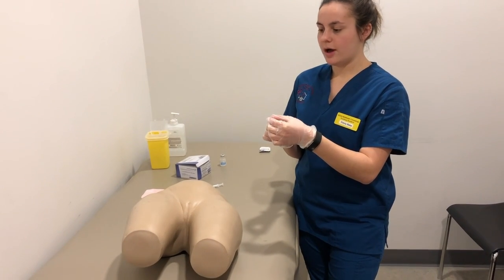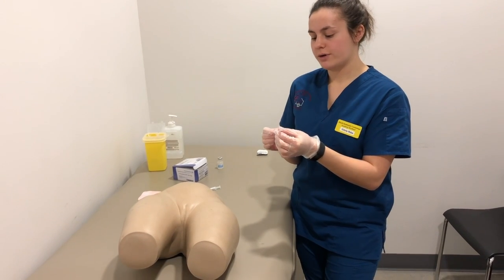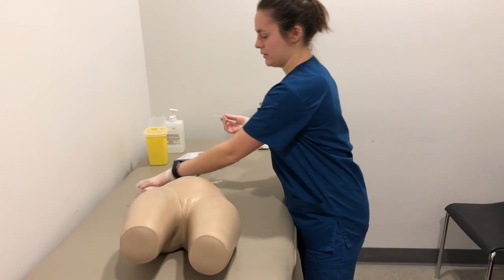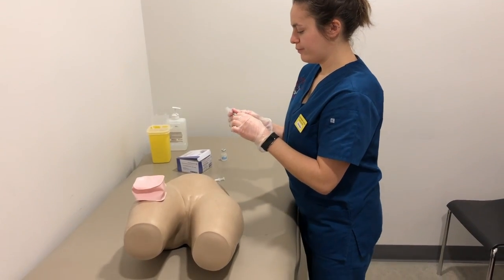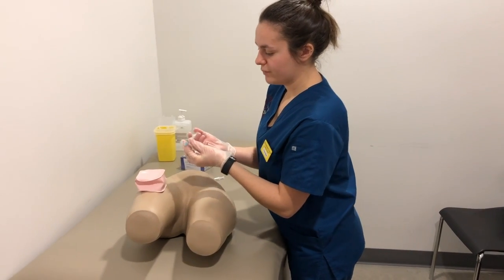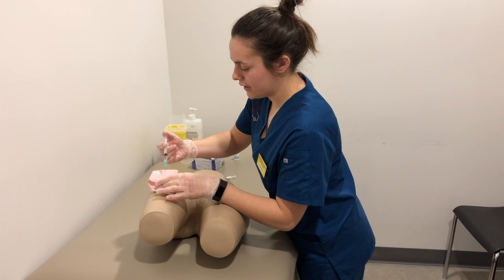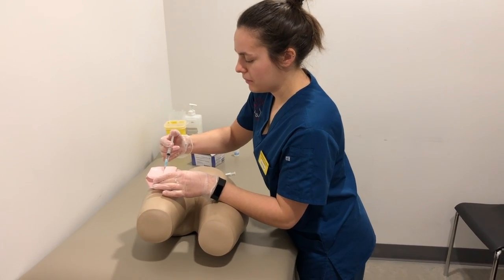So I'm going to pull the sheath off. For a subcutaneous injection, I would like to inject at a 45-degree angle. So I'm going to pull the sheath off and inject at a 45-degree angle with the bevel up.